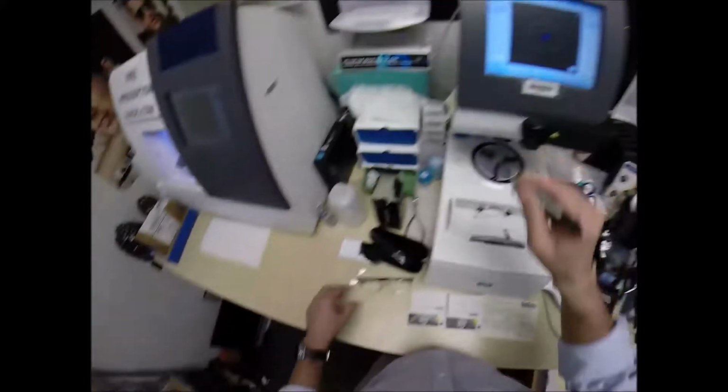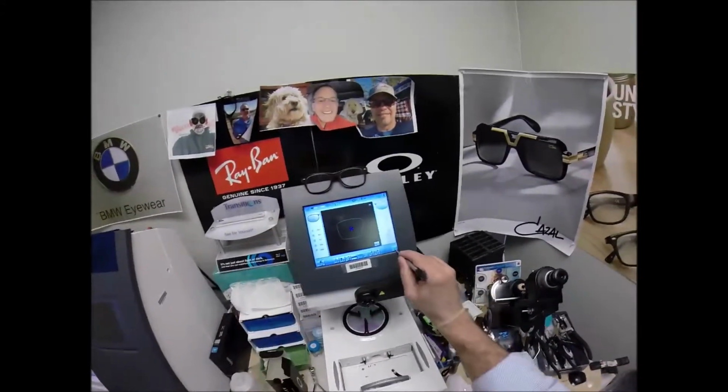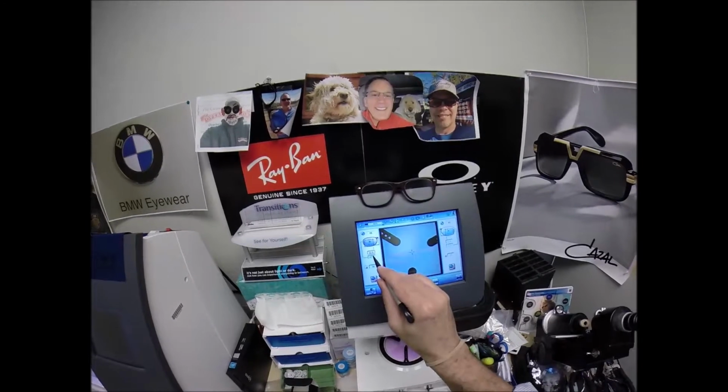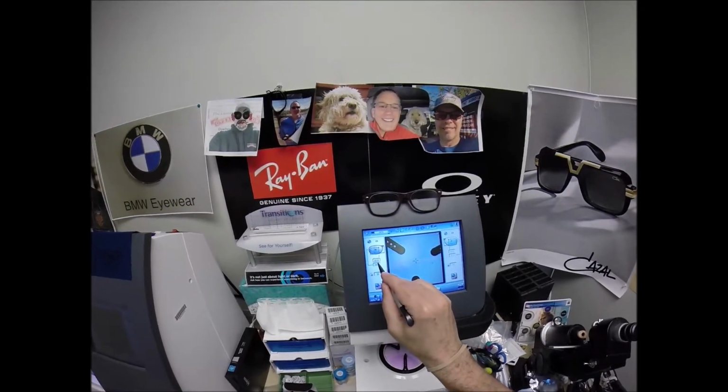So, that is the shape of the lens we'll be cutting. Don't believe me? There it is. So let's move on to the next screen. Your pupillary distance is 32 for each eye. The computer starts at 32.5, so I'm going to tap the minus button one time. It's going to come down in 0.5 millimeter increments and get to 32.